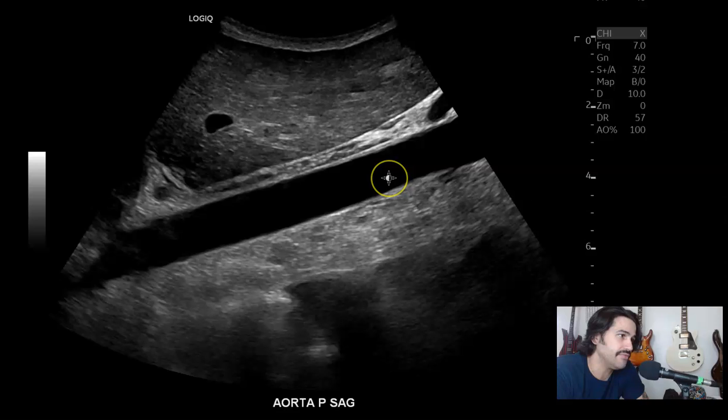It goes up to 10 megahertz, I believe. Very, very good imaging. Obviously a patient has to be slender or pediatrics for it to really shine. But on adults that are slender, you can also get some really great images. So aorta in sagittal, proximal.